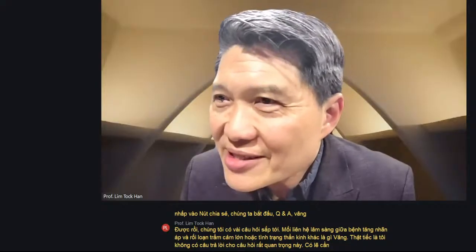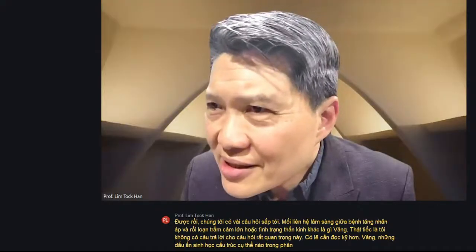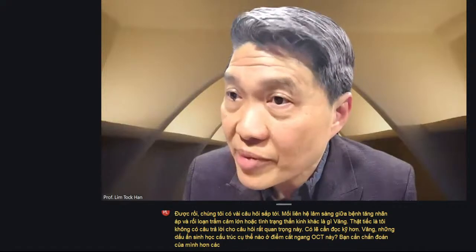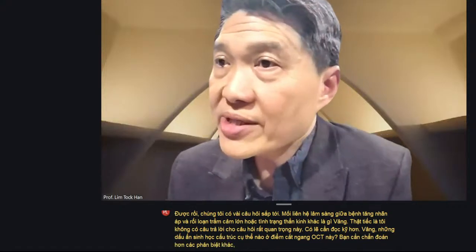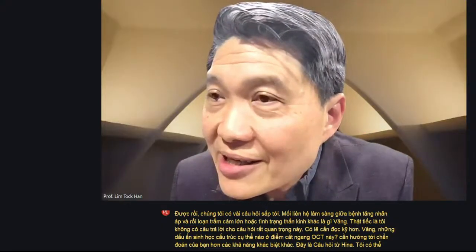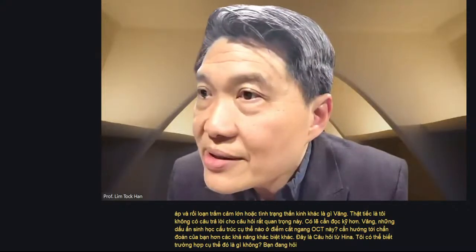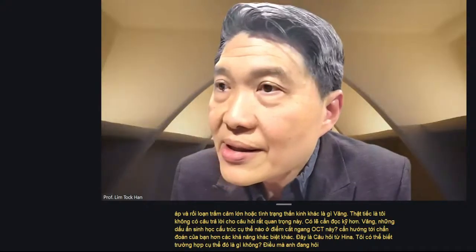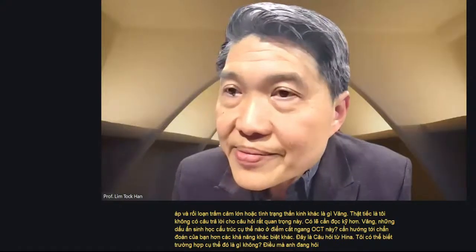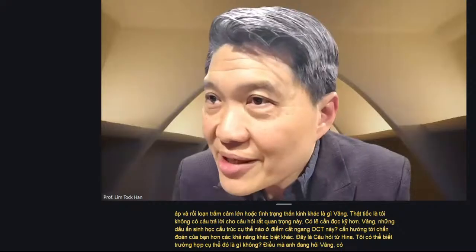What specific structural biomarkers in this OCT cross-section point directly toward your diagnosis over other differential possibilities? This is a question from Hina. May I know which particular case you're asking about? Perhaps we wait for Hina to type in, and we go to another question first.